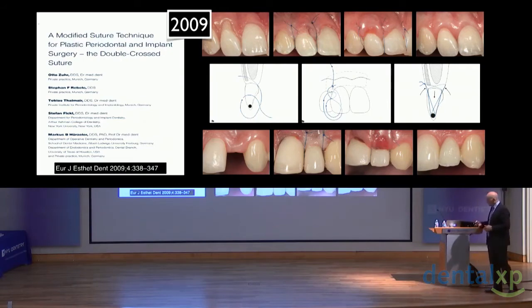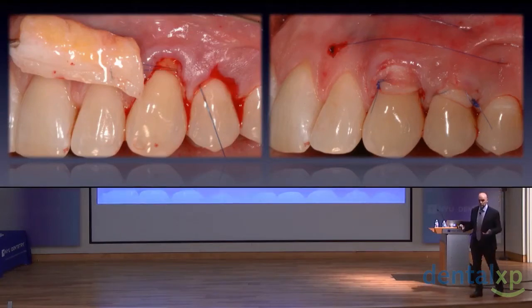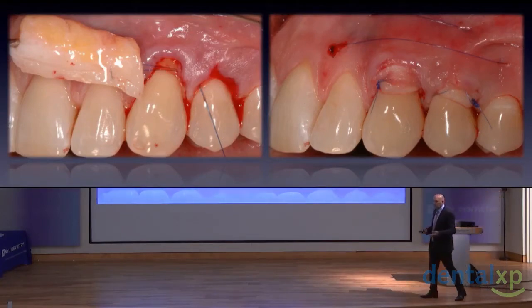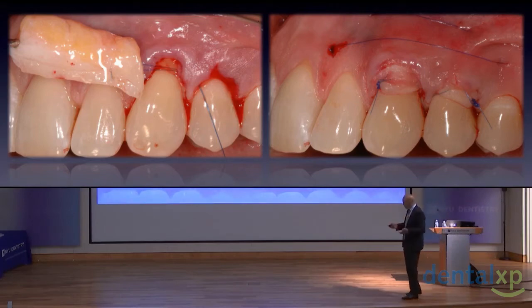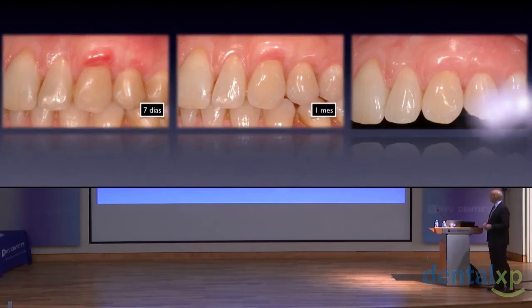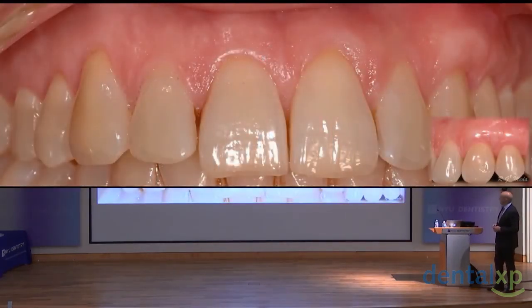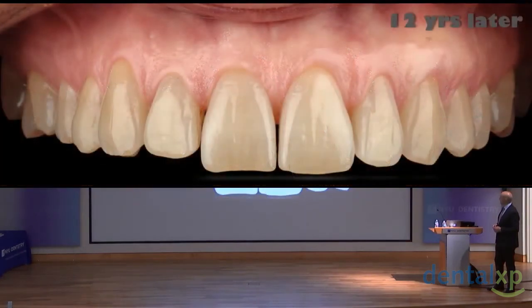The problem is, well, actually there is not any problem, but I analyzed my clinical cases done before 2009. Look at this clinical case. We didn't use that suture at all because we didn't know it. So let's look at the result. Years later, I have a very stable and nice result, 12 years later.